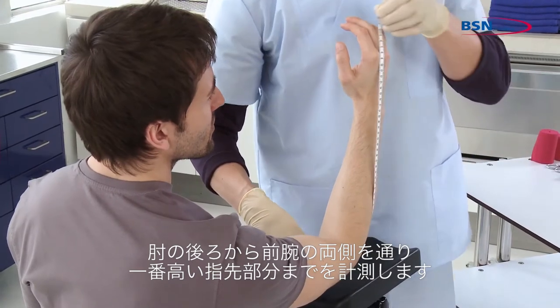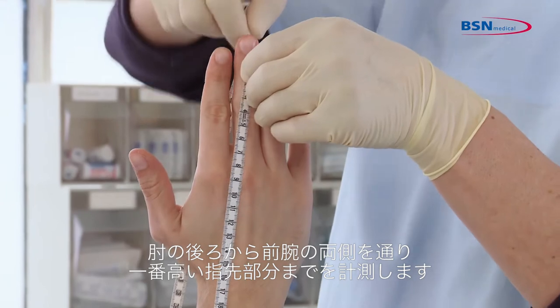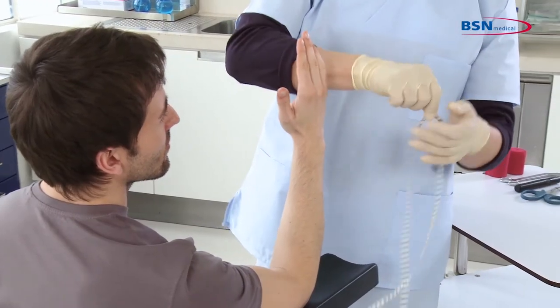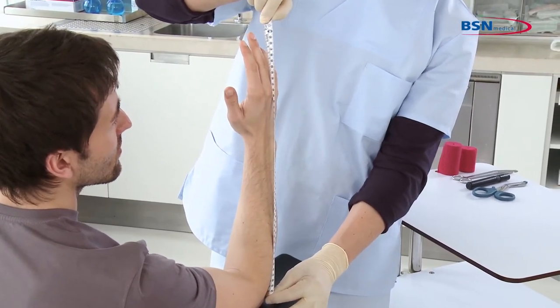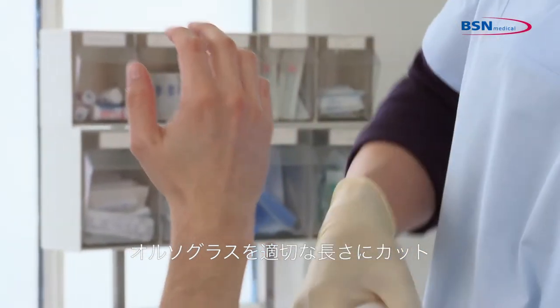To start, measure from behind the elbow coming up both sides of the arm to the highest tip of the fingers. Then cut the desired length of the splint.